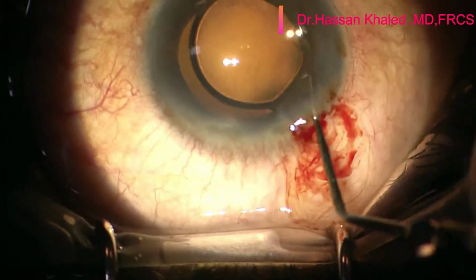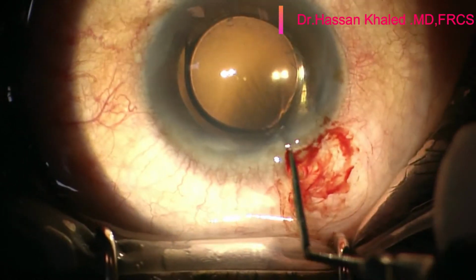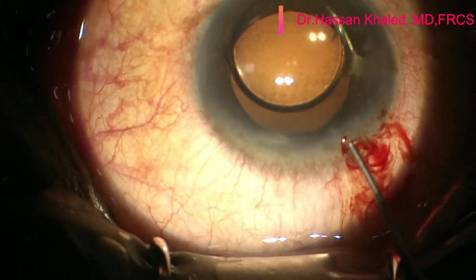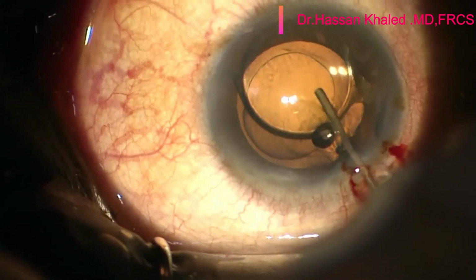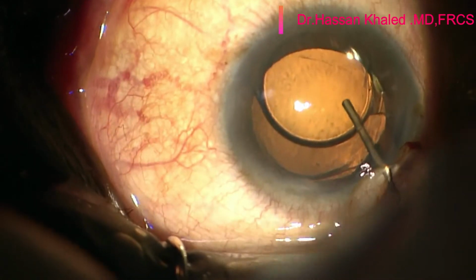Now I'm trying to be sure that the haptic is free in the anterior chamber and is not touching the cornea, and I'm trying to make a space to reform the capsular bag by injecting the OVD to implant the new IOL before removing the old IOL from the anterior chamber.